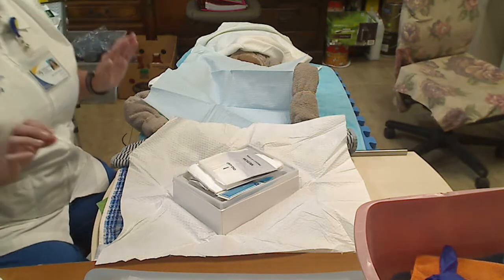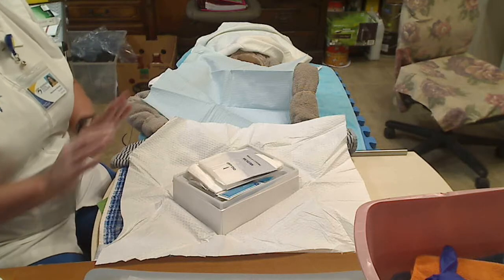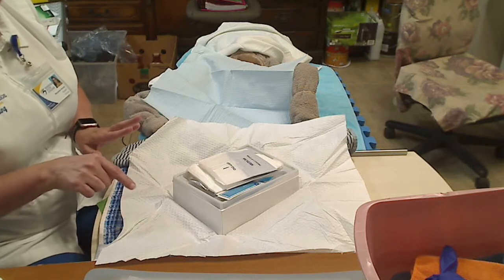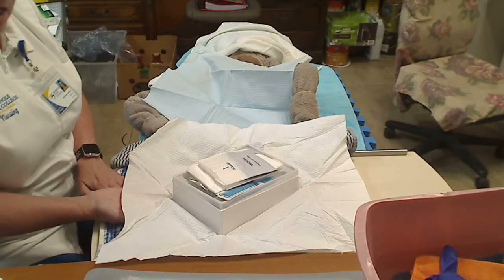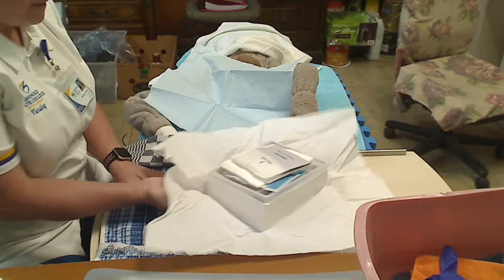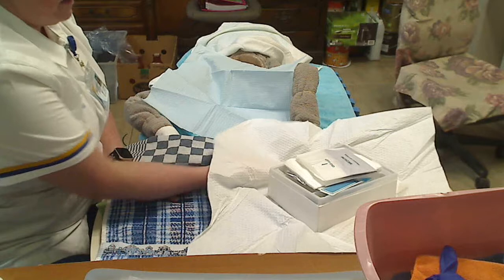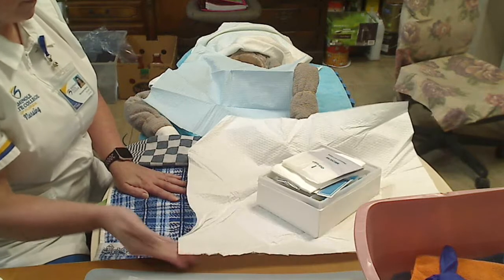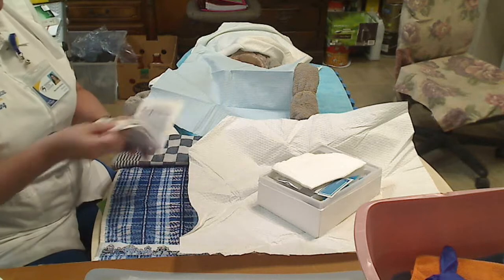From here, I have to break sterility by crossing it over this little drape, but I'm going to try my best to keep it as far away as possible. So I'm going to shift my kit away from me. It's a little more difficult being that I have a cotton sheet down below. All right, so from here, I'm going to go ahead and get my gloves.